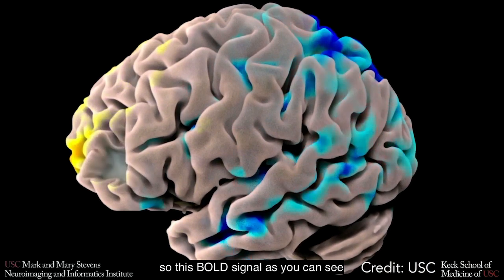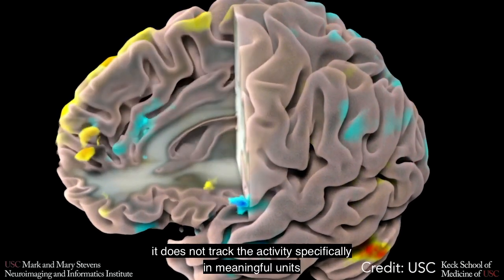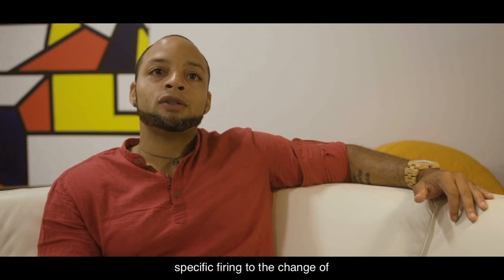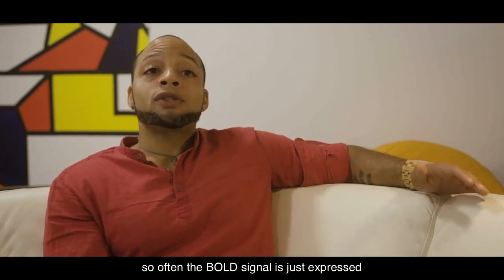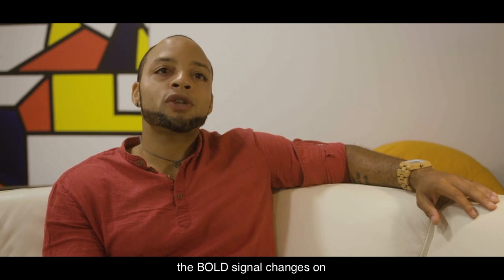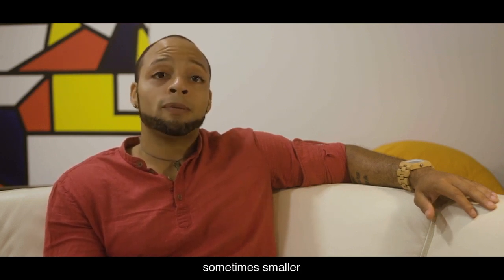So this BOLD signal, as you can see, is a very indirect measure of neural activity. It does not track the activity specifically in meaningful units like spikes per second. The relationship between specific firing to the change of blood oxygenation is complicated. So often the BOLD signal is just expressed as percentage change from baseline because it is difficult to give it a more precise and meaningful unit. The BOLD signal changes on the order of just 1% or 2% change, sometimes smaller.